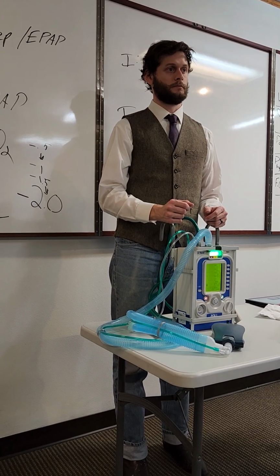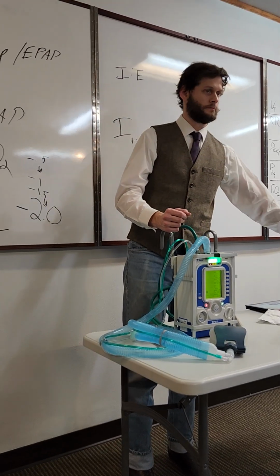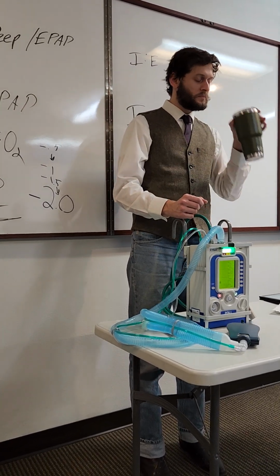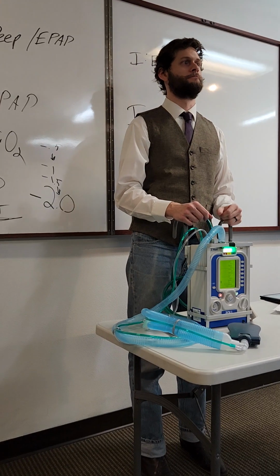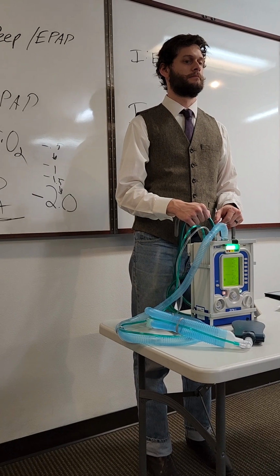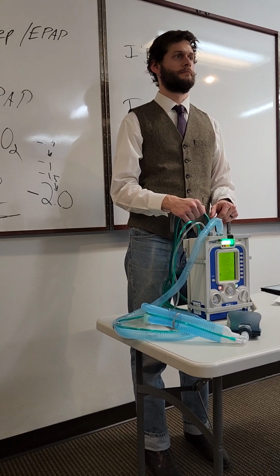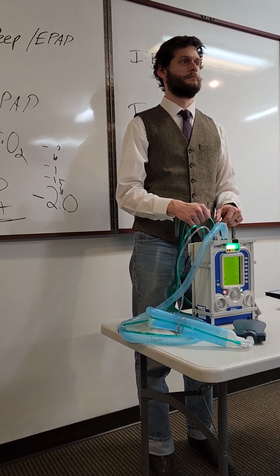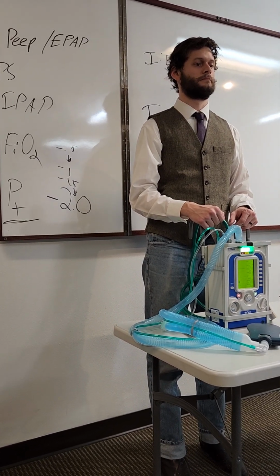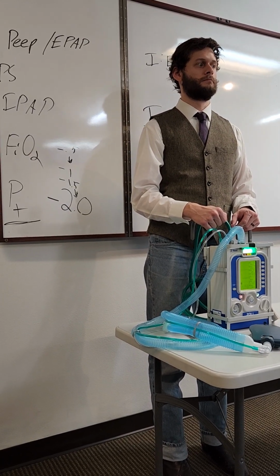Okay, as the paramedic and the company boss, how much of this do you want us as EMTs to be able to monkey with? You can initiate it, set it up. You can do a circuit check, push buttons, and if the medic you're with feels comfortable with you putting in settings, you can do that, but ultimately it lies on the paramedic running the call. They need to recheck the settings and make sure everything's correct. So you can assist as much as the medic allows you to, but ultimately it falls on them and their license if something goes wrong.